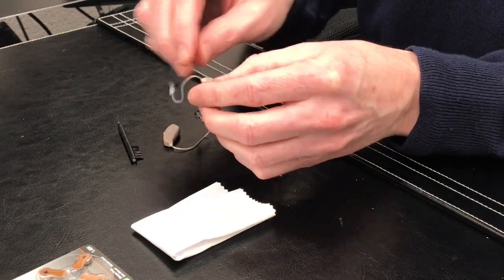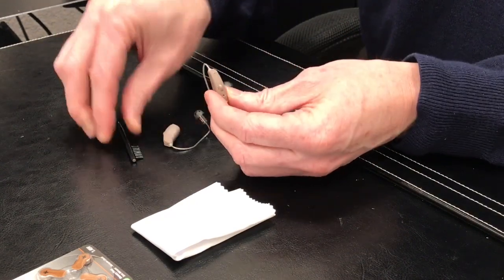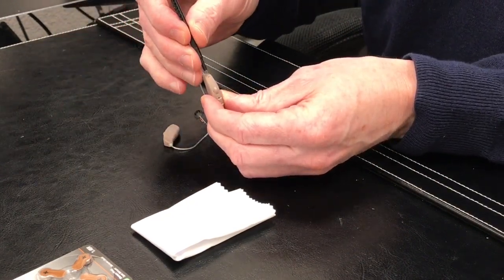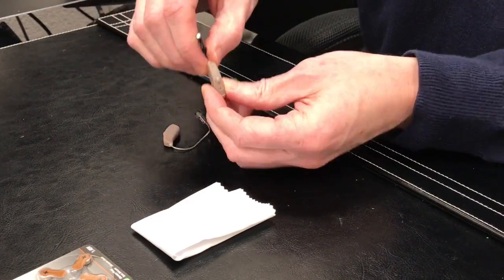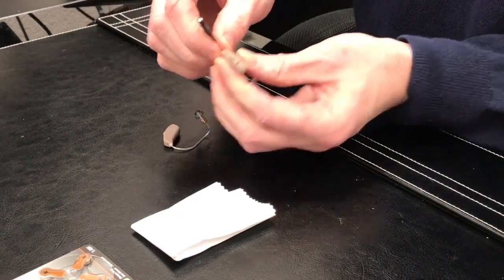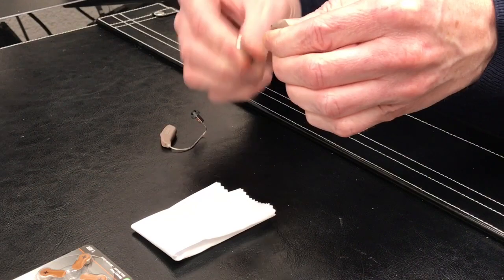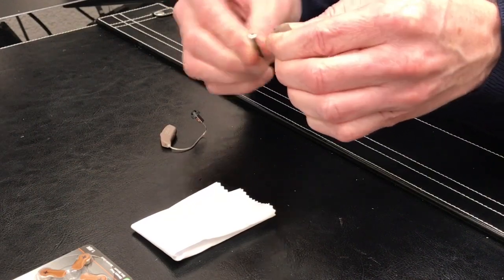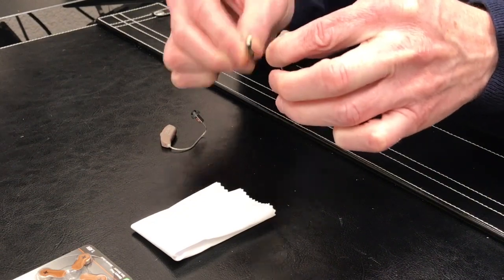Now on the other end of the hearing aid, you've got your microphones opening here and opening at the bottom. Tilt that towards the ground and just run your brush over that area. Again, 15-20 seconds.